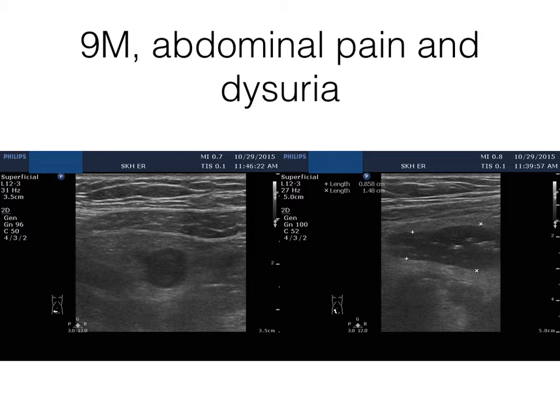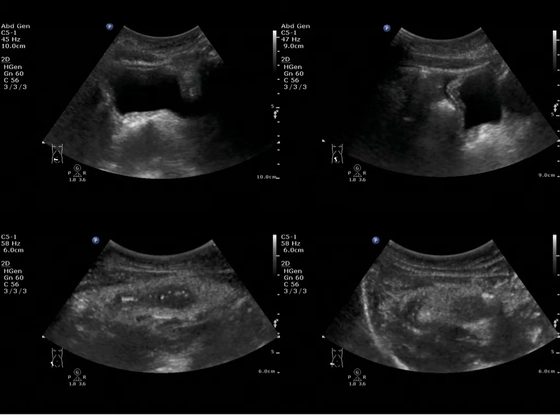The scan by the pediatric GI doctors turned out to show enteritis only, and he just needed observation. The next morning, the patient came in complaining of dysuria. So my colleagues asked me to scan what is going on in the pelvis and whether the patient developed appendicitis. So let's see what's going on.